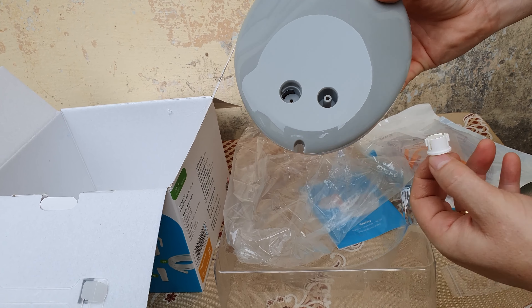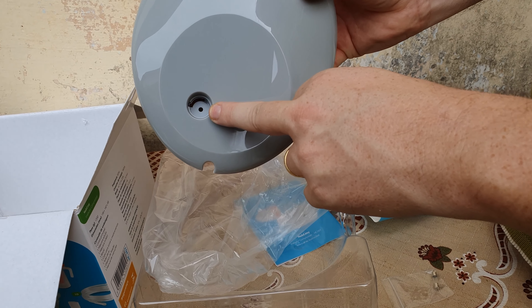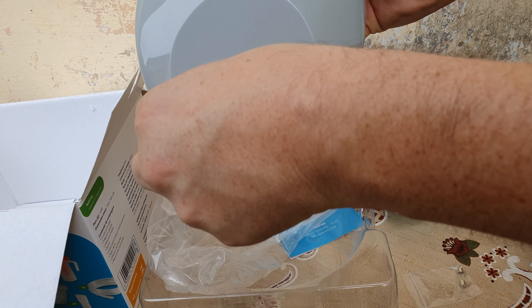Tem a parte aqui do filtro, onde você coloca uma borrachinha, uma esponjinha, para proteção mesmo do aparelho. É um aparelho muito interessante e um ótimo custo-benefício. Eu comprei por R$135,00, sendo que os nebulizadores aumentaram o preço — tá na faixa dos R$160,00, R$170,00, R$200,00. Para quem precisa, é uma mão na roda. É maravilhoso as pessoas conseguirem utilizar isso para respirar melhor e ter uma qualidade de vida um pouco melhor.